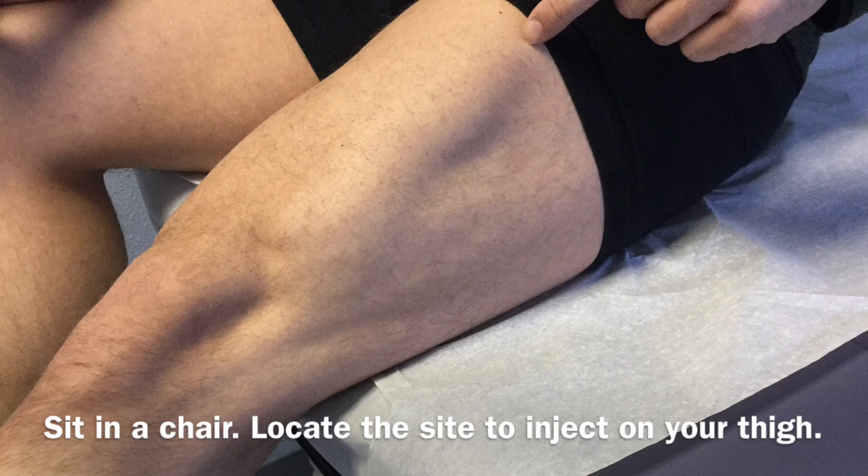Next, you'll want to take some time, sit in a chair, and locate the site where you will inject the testosterone in your thigh. This is called an intramuscular injection, so we want to make sure that we inject into a muscle. The easiest place to do this as a beginner is your quadriceps muscle, which makes up the bulk of the front of your thigh. In order to locate those muscles, go ahead and extend your knee — it tightens up your thigh — and as you see in the picture, you can tell where there's a good amount of muscle in the leg. You want to make sure that your location is not too far lateral, so not too far down the side of your thigh, and not too far medial — up toward the midline of the thigh — but right in between is the perfect location. Take some time to locate that spot.